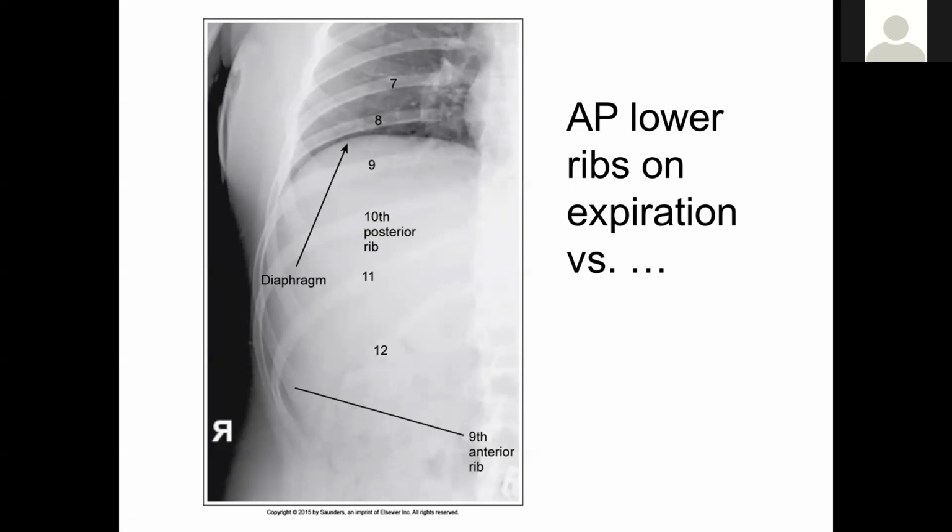Now, some facilities do their lower ribs bilateral, even on a unilateral rib series. I have never had any complaints for turning in a unilateral lower ribs on a 10 by 12 cassette or light field. So if you're going to do a unilateral lower ribs AP, you have your 10 by 12 field lengthwise. You want to feel for your patient's iliac crest and have no light going below the crest. There are no ribs below the iliac crest. So it just gives you the bottom portion, and then you should have light to the mid-chest, the sternum, and light to the skin line.